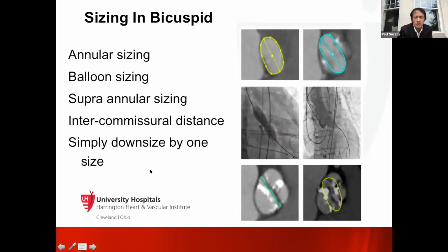Yeah. So can I just ask, obviously there are multiple valve choices here. So there's annular, there's 5 millimeters above. What other ways of sizing it, perimeter, diameter, what have you? Can each of you just tell me, for Edwards, for Evolut, for Lotus, or others, what is your preferred way depending on what your valve choice is going to be? Steve, you want to start?